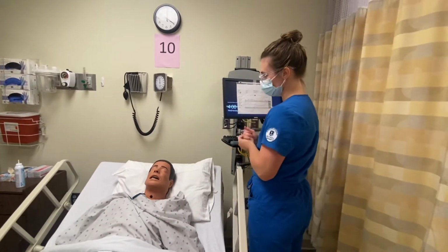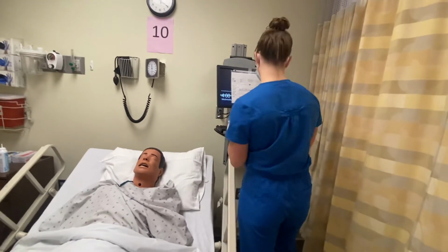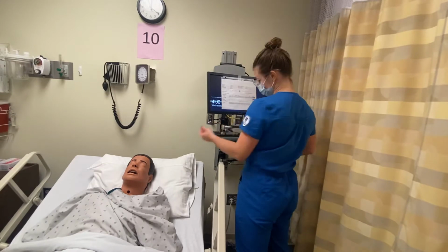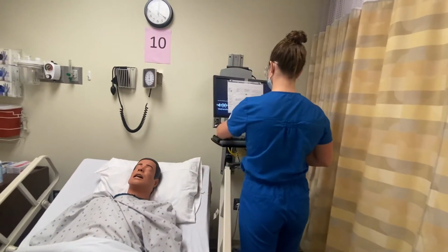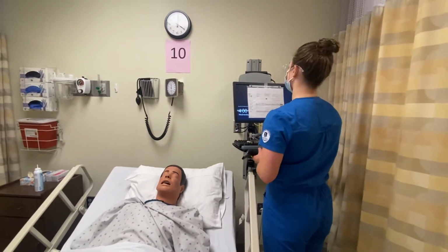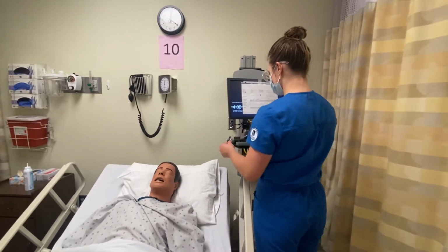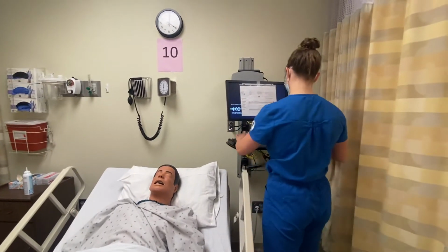Do you have any allergies, especially to tape or chlorhexidine or latex? Nope. Okay. The reason I ask that is because we're going to be doing a central line dressing change, like I said, and we use some of those materials in that procedure, so we don't want any reactions, okay? Okay. So before I get going, I'm going to verify that we do have an order in here for a central line dressing change, and then I'm going to go ahead and do a couple of med checks, because we are also going to be flushing your central line when we're done changing the dressing, okay?